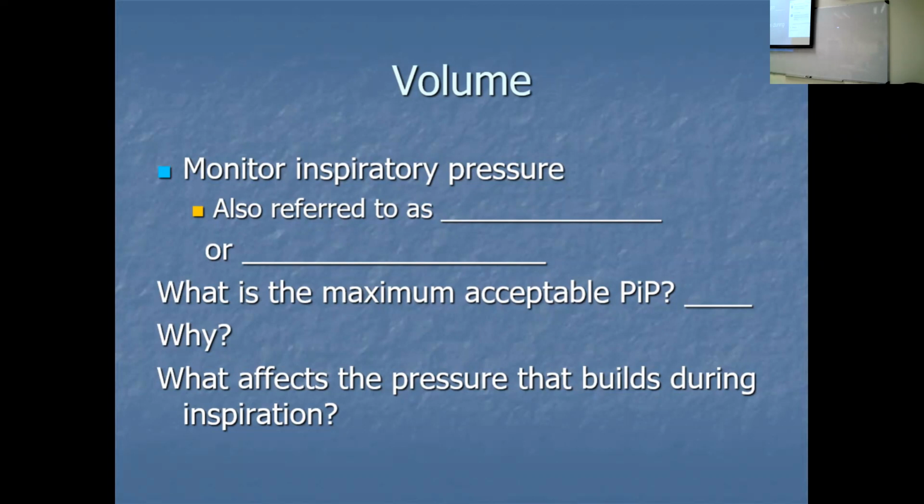So I try to abbreviate things just so I don't have to give you too much information, but when I abbreviate, I'm not giving you a whole story. Peak pressures can go high if the patient bites on the endotube. That pressure is not being felt in the alveoli, so it doesn't really harm the alveoli. If they go into bronchospasm, high pressures build. That's not affecting the alveoli.